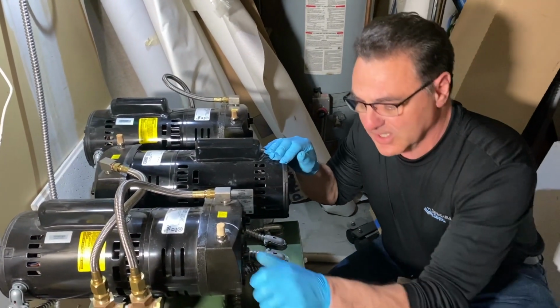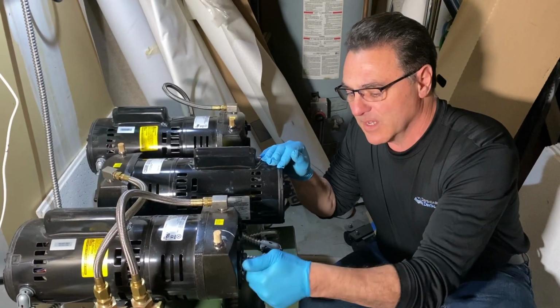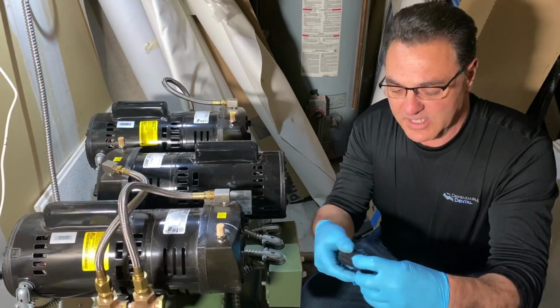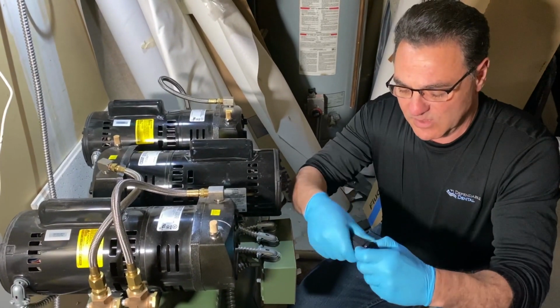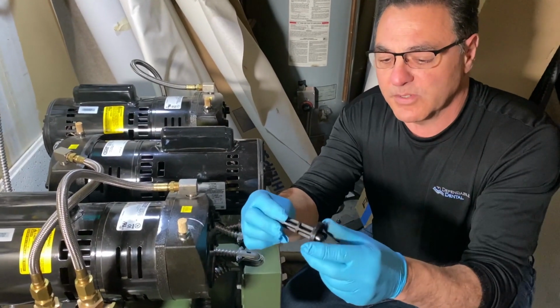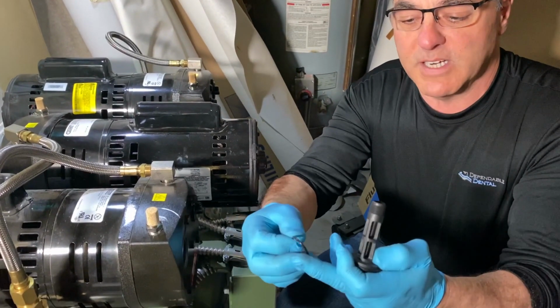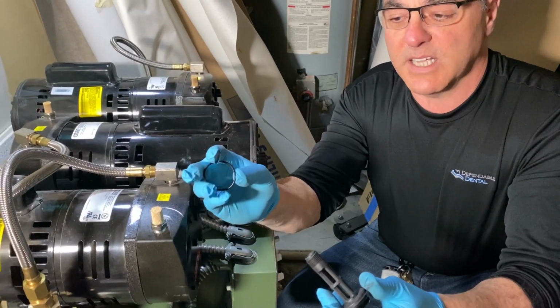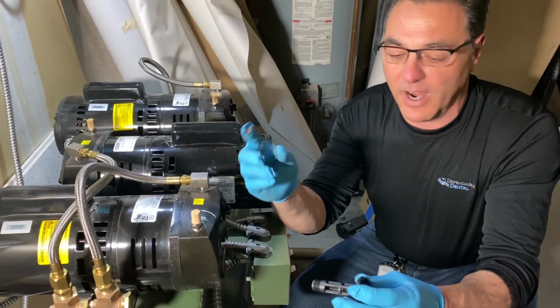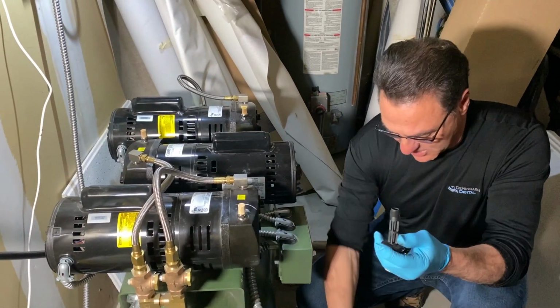Now we're going to be changing the air intake and exhaust filters. They're basically felt filters. Currently they're only priced at about $12 a piece. The other thing you should always have on hand is these, called the spindles. After a while, on the older units, the spindle and the O-ring get dry and hard. Right now this O-ring is flexible. Because of the heat that the head gives off, these actually dry up and get really hard. If I was to do that, they would crack into quite a few pieces. But these are good right now.